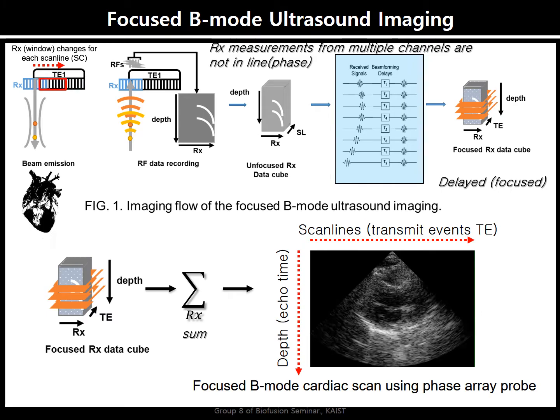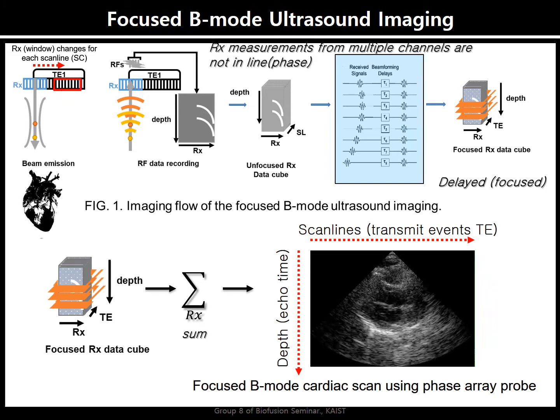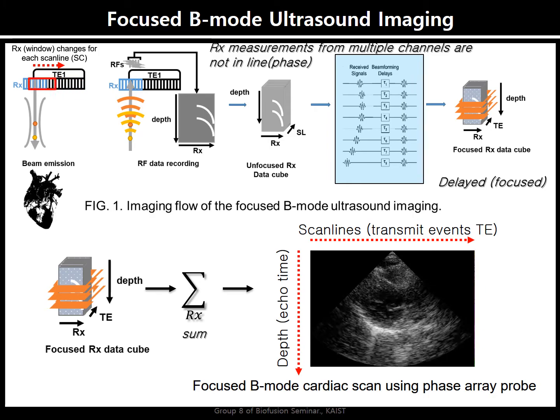Due to the non-invasive, radiation-free, and real-time acquisition features, ultrasound imaging is considered a first choice for a variety of clinical applications, such as fetal or cardiac imaging. Before presenting my actual work, I would like to give you a brief introduction on the ultrasound imaging mechanism.